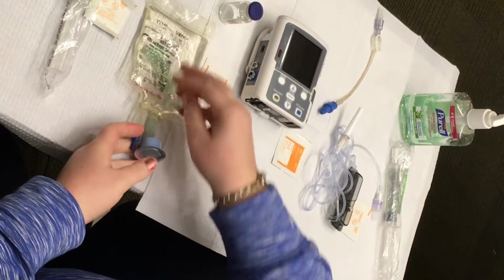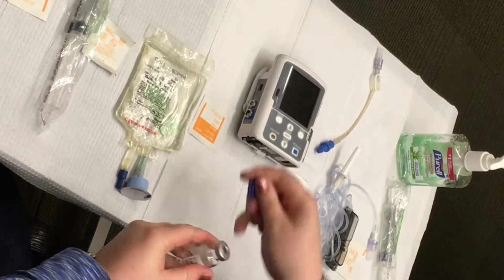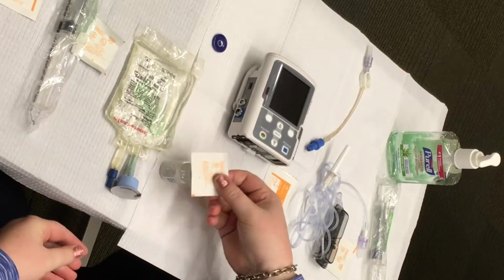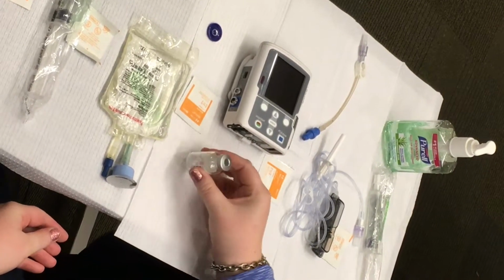Take the vial that contains the medication into one hand and remove the plastic cap with the other. This will expose a rubber stopper in the center and top of the vial. Clean the rubber stopper with an alcohol pad for 15 seconds, taking care not to touch the clean rubber stopper.